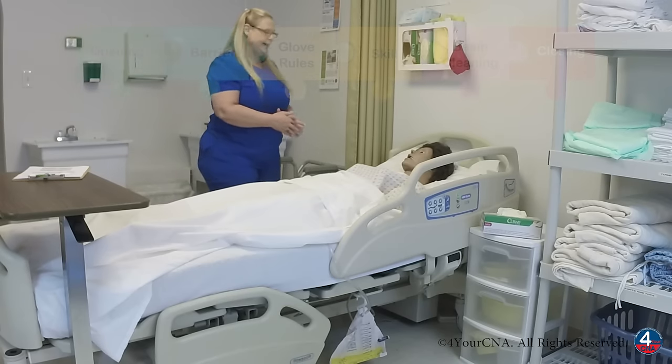Hello, Ms. Jones. My name is Patti. I'm your CNA today. How are you? I need to empty your urinary drainage bag. Is that okay?